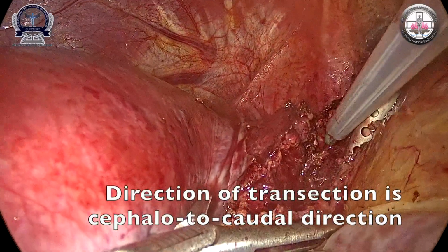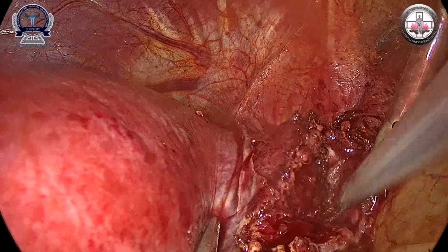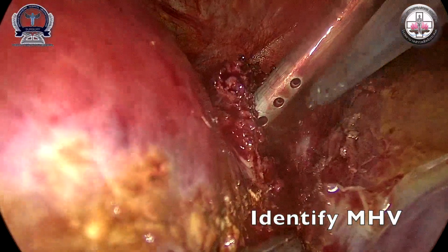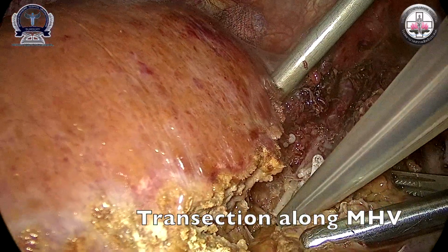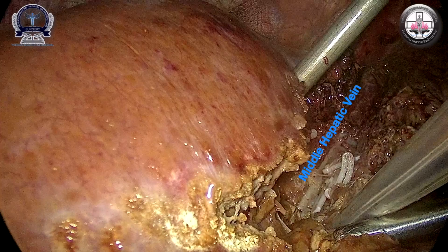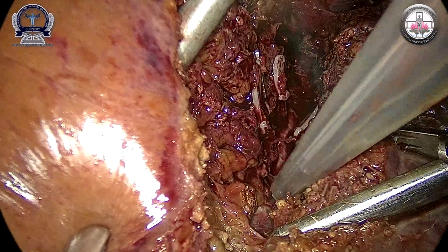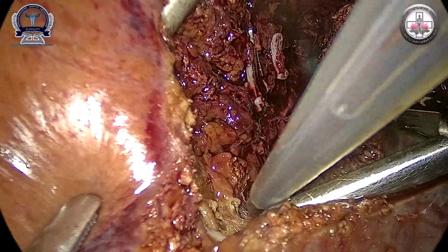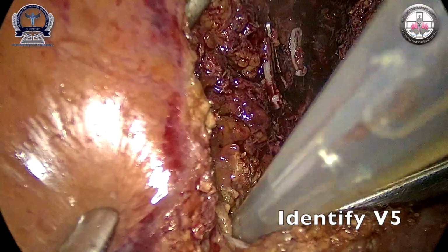The direction of transection was cephalo to caudal, along the middle hepatic vein. The hepatic vein of segment 5 was identified.